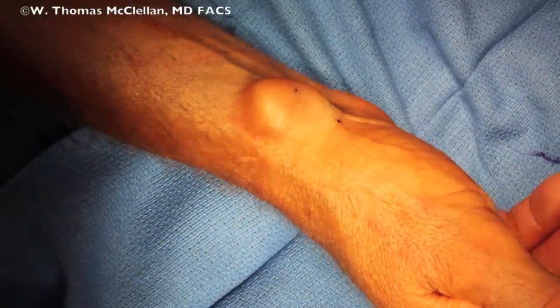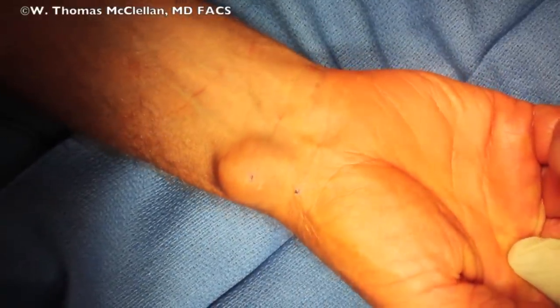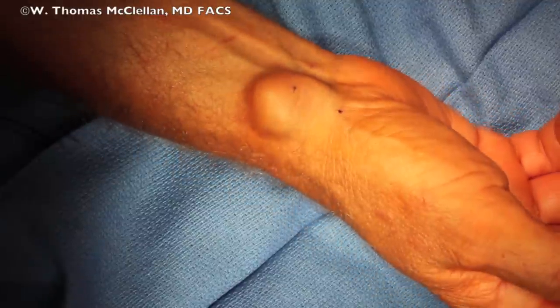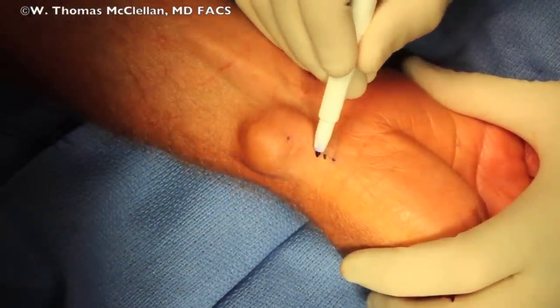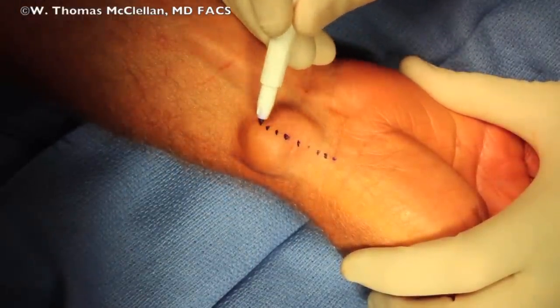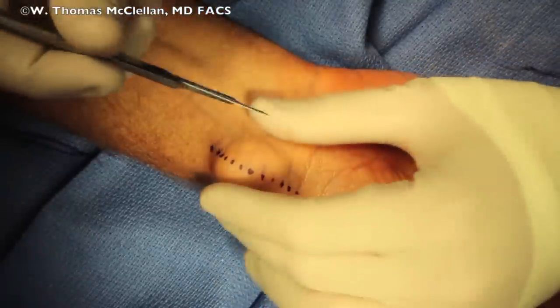As you can see here, here is the ganglion cyst prior to incision. I design a longitudinal incision directly over the lesion, medial to the radial artery.